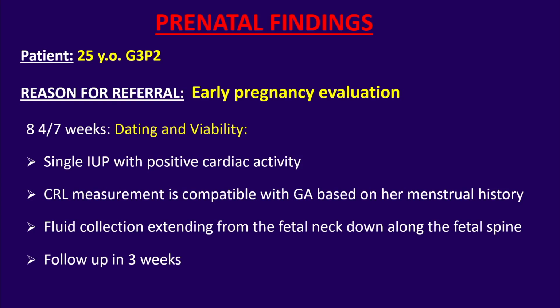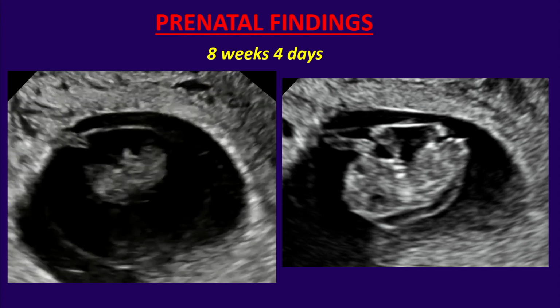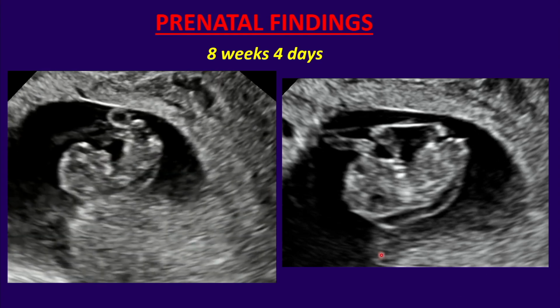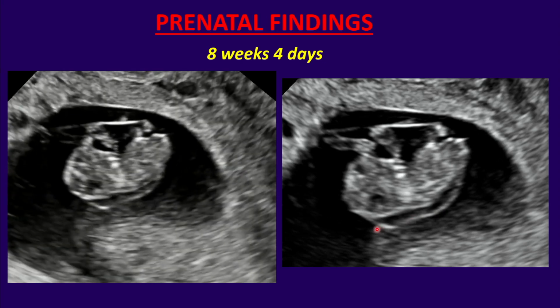But what was really concerning, even though at that gestational age it's probably not the scope of ultrasound imaging, is that we identified a fluid collection extending from the fetal neck to the spine and the entire body. So an early cystic hygroma was suspected, but we were very cautious to make this call at that point, and we brought her back in 3 weeks. So this is our early imaging at 8 weeks and 4 days, and you can see significant fluid collection pretty much along the entire fetal body.